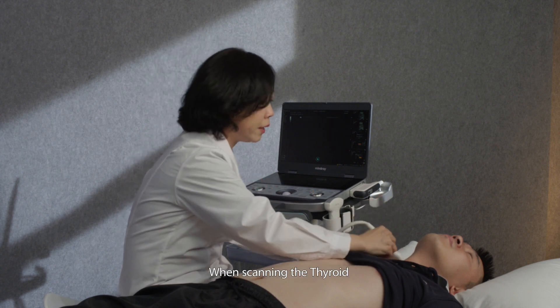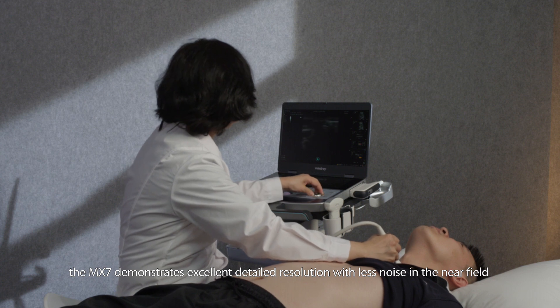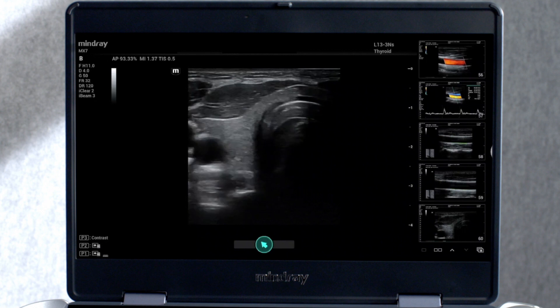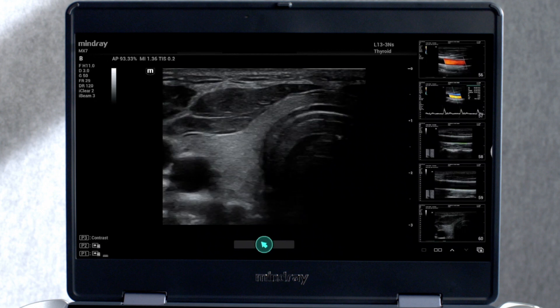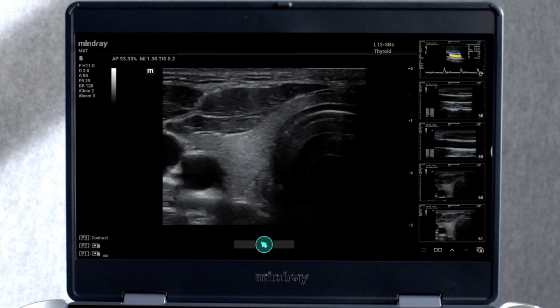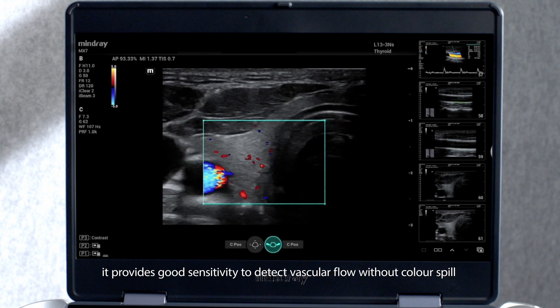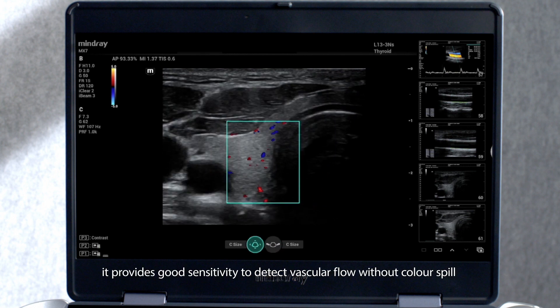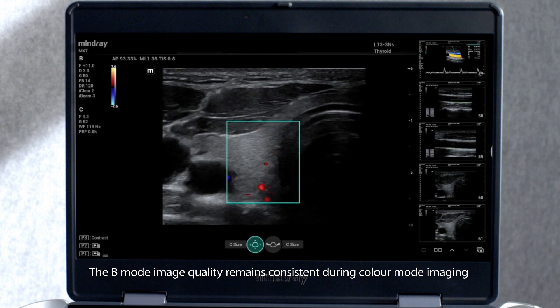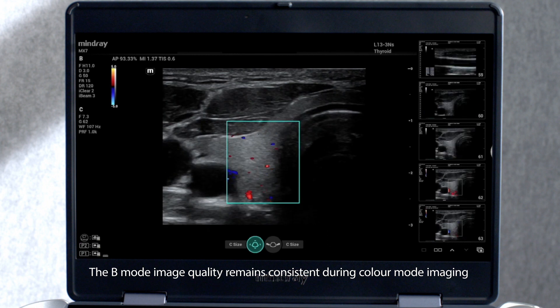When scanning the thyroid, the MX-7 demonstrates excellent detailed resolution with less noise in the near field. When colour flow is added, it provides good sensitivity to detect vascular flow without colour spill. The B-mode image quality remains consistent during colour mode imaging.